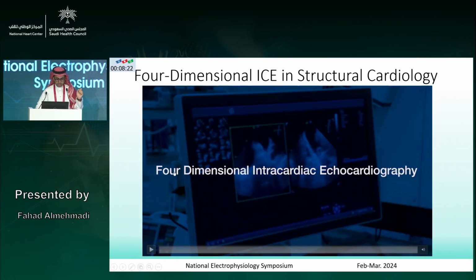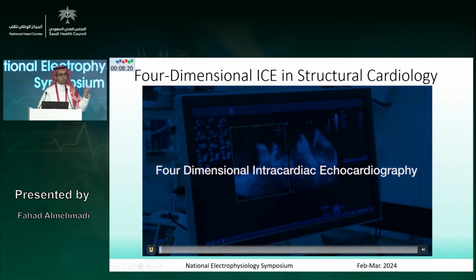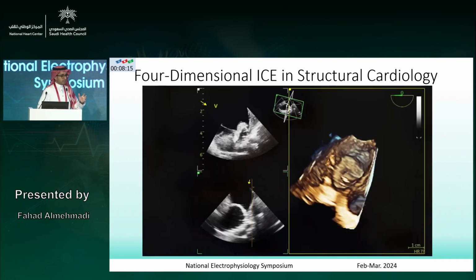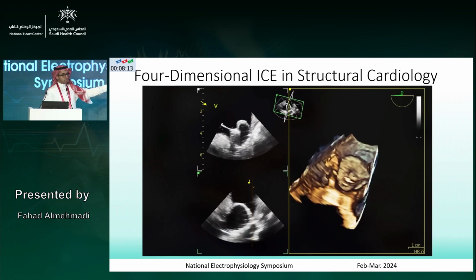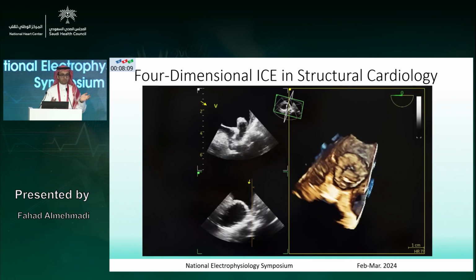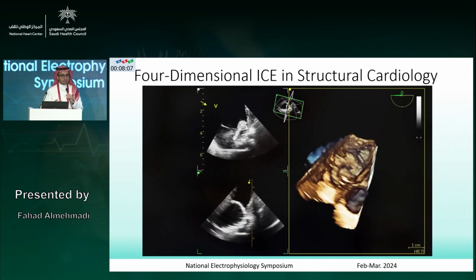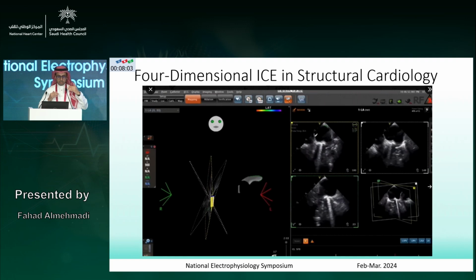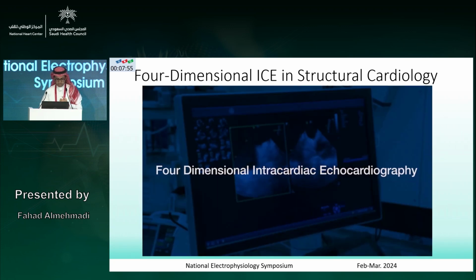And they also have the 4D ICE. We are all used to the 3D echo. This is more of a 3D version of ICE. They call it 4D, I don't know why, but it gives you very well two views, mostly of the appendage for structural procedures.